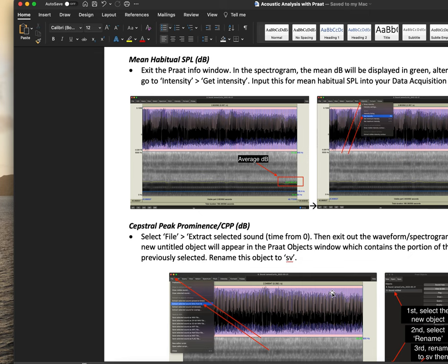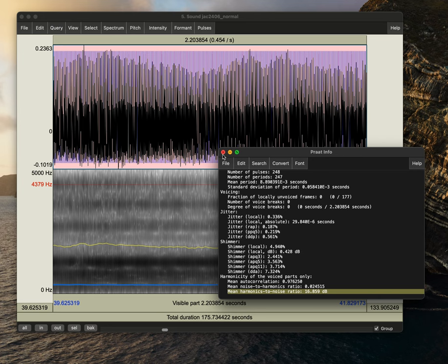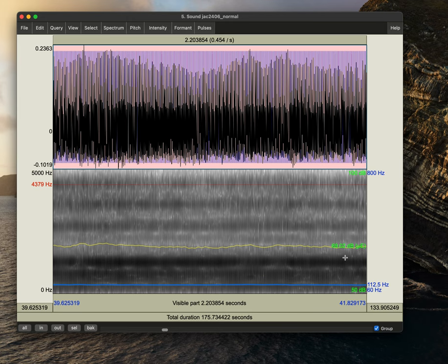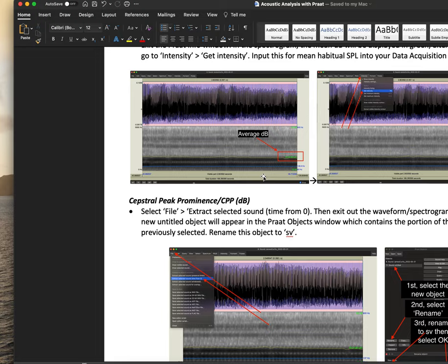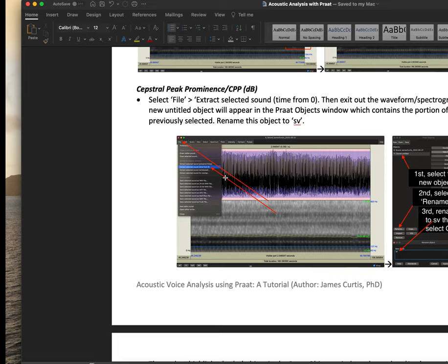The next thing we'll do is obtain our mean habitual SPL or decibel. And so to do this, we'll exit out of the voice report and we can see the mean dB highlighted right here. Alternatively, we could go to intensity, get intensity, and this will show us 69.02 as well. So that is our mean intensity.